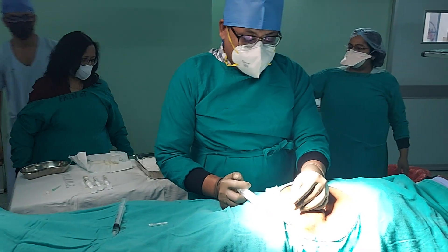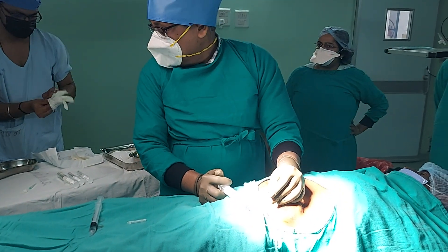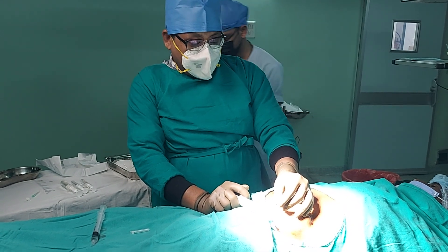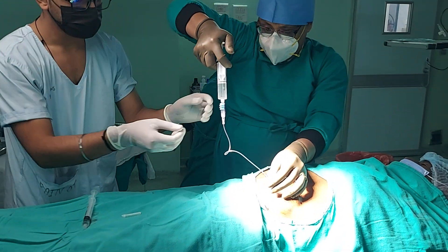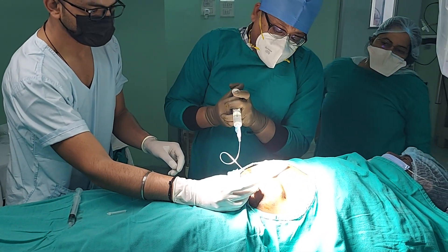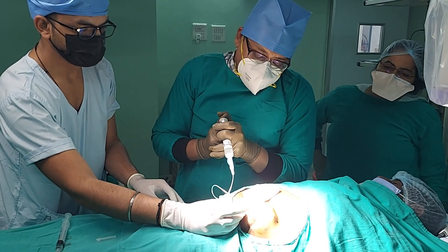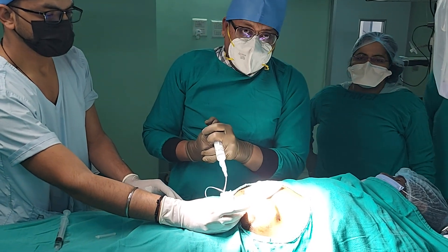I am going to get one of my colleagues to hold the needle. So this is how we do the refilling process — you can see how much pressure there is and drug is coming back, but we don't worry about that. This is how we do the refilling process of the intrathecal pump at Dr. Ram Manohar Lohia Institute of Medical Sciences, Lucknow. Thank you.